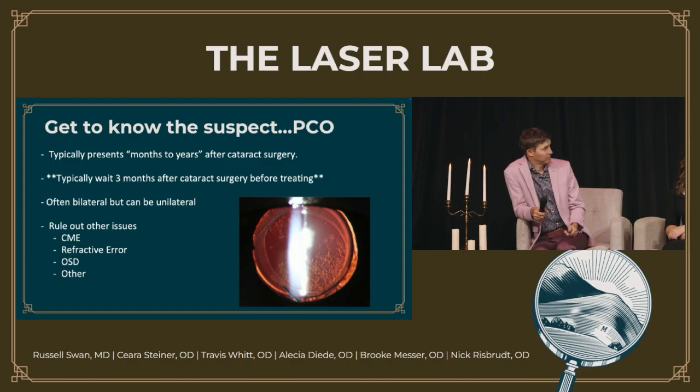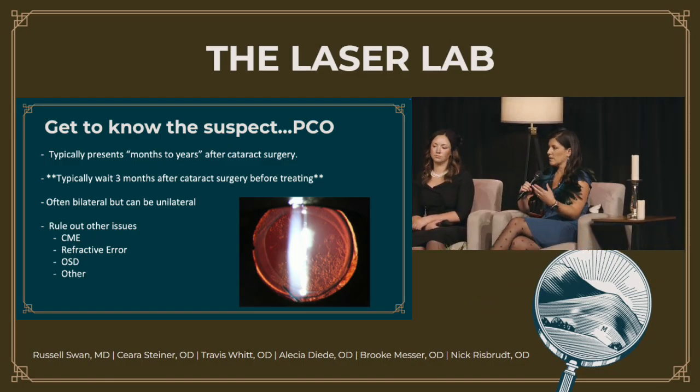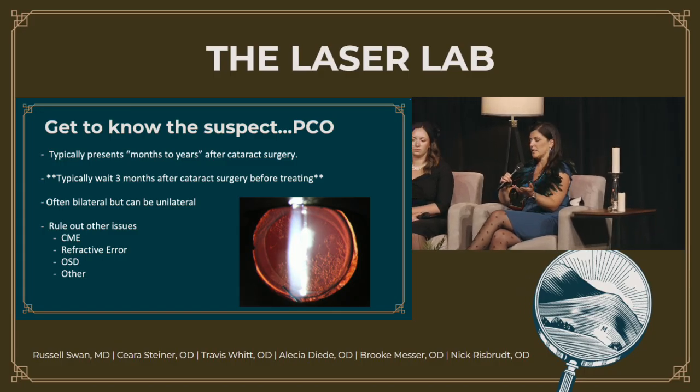Yeah, so first we'll want to find out their complaints, make sure it's warranted to actually do the procedure. So I'll ask about nighttime driving, other dim lighting conditions that may cause a smearing in their vision, especially when patients say, oh, my vision was better after cataract surgery, I thought it was great, and now I'm not sure that I'm seeing as well. To me, that's an obvious change in their capsular opacity.